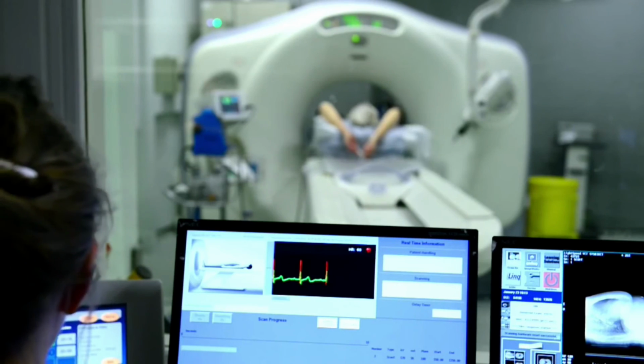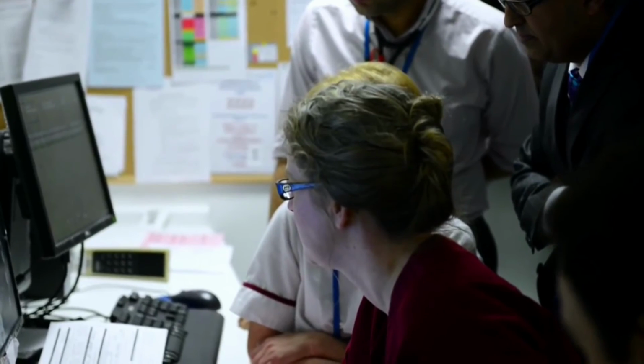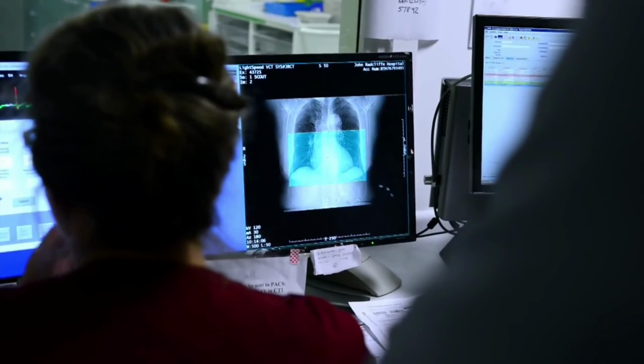There are a couple of key steps for the CT coronary angiogram. The first thing is that the patient's heart rate needs to be well controlled with a medication like a beta blocker. And the second thing is they need to hold their breath, taking the same size breath each time they receive the instruction. Breathe out. Hold your breath. The scan itself takes about 10 to 15 minutes.